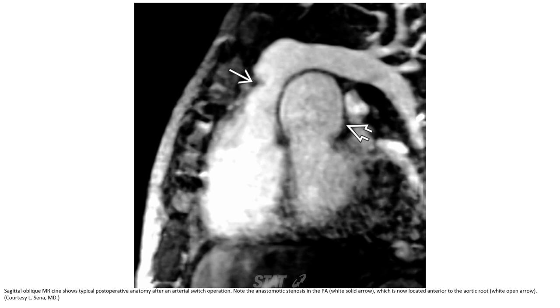Axial cardiac CTA showing typical postoperative anatomy after the arterial switch operation — anastomotic stenosis in the pulmonary artery, which is now located anterior to the aortic root.